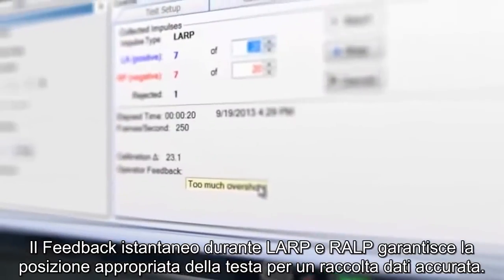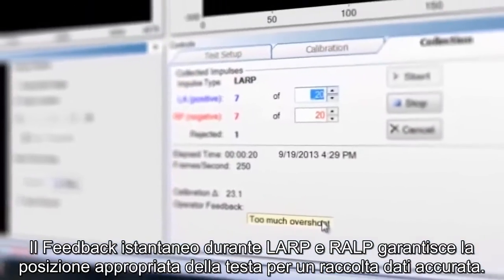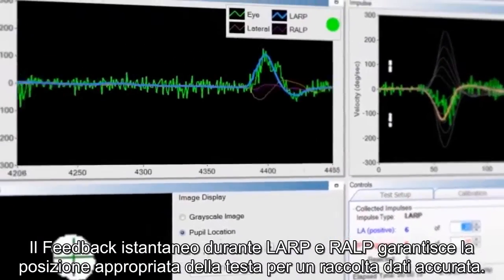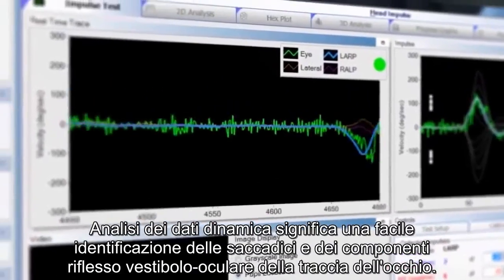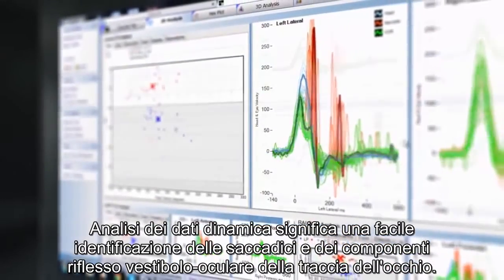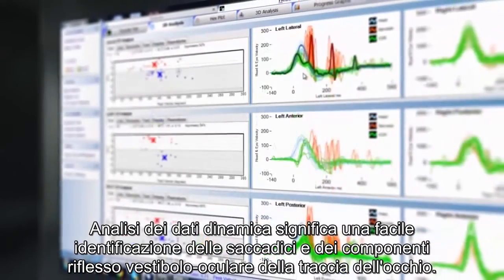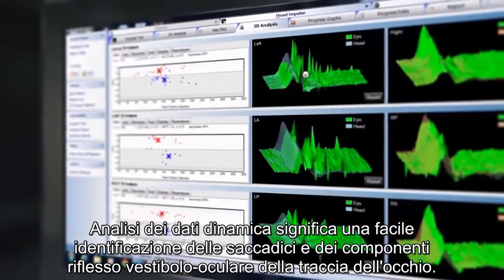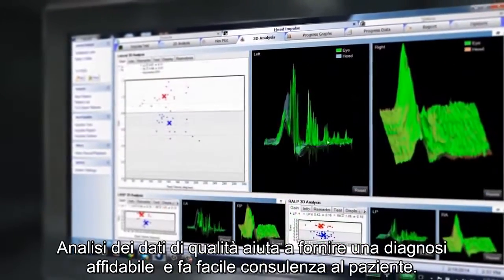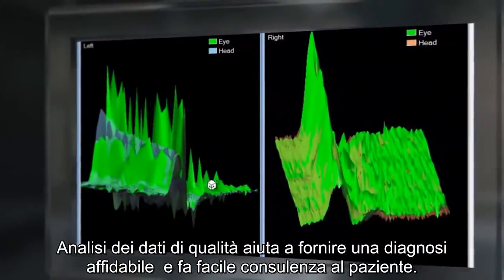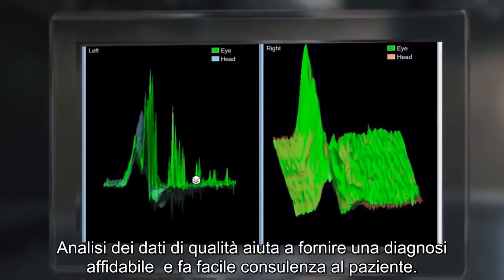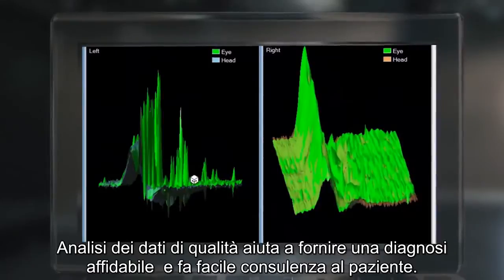Instant feedback during LARP and RALP ensures proper head position for accurate data collection. Dynamic data analysis means easy identification of the saccades and the vestibulo-ocular reflex components of the eye trace. Quality data analysis assists in providing a reliable diagnosis and makes counseling the patient easy.